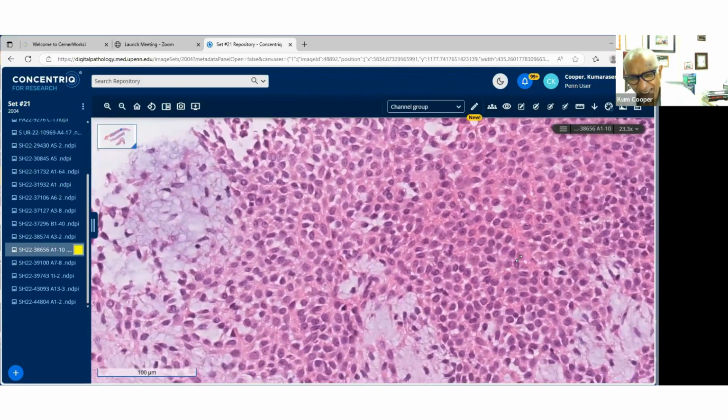So if you had any doubts about chordoma, if you wanted to prove that, remember you can do the epithelial markers, S100, and both of those would be positive, including EMA, epithelial membrane antigen. But the key stain for chordomas is brachyury, which was negative in this. And so extraaxial chordomas have been described, and that's again a very important differential diagnosis.